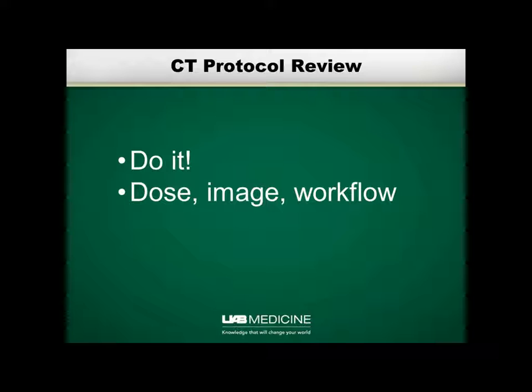I was told that the two single biggest problems in our department are MR hanging protocols and CT hanging protocols because of the non-standard Recon labels. It's really throwing our radiologists' efficiency downward. And so once I'm done with getting the CT protocols into shape, I'll start banging on MR's door. And the third thing is know your scanners. Every scanner has got limitations that will affect the way you put together CT protocols.